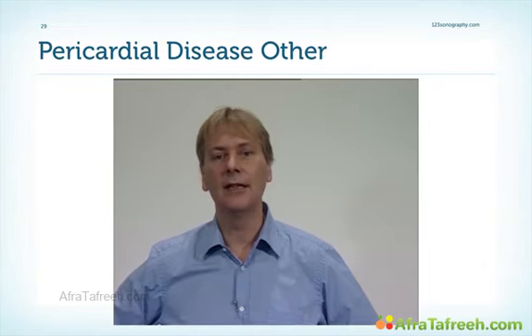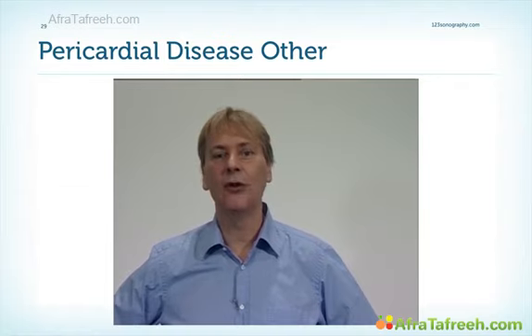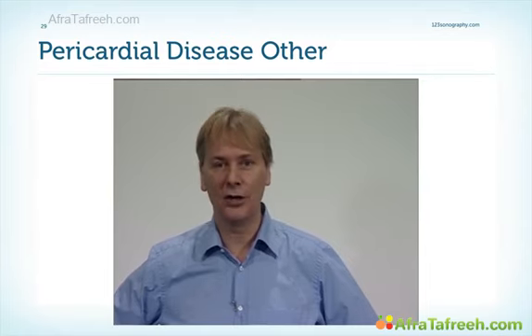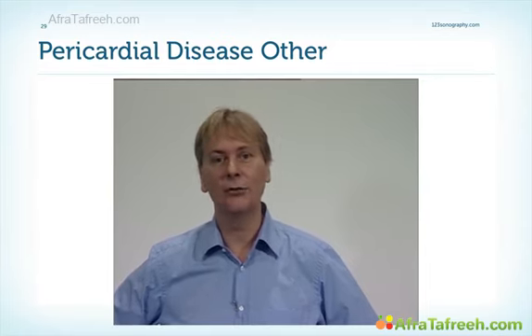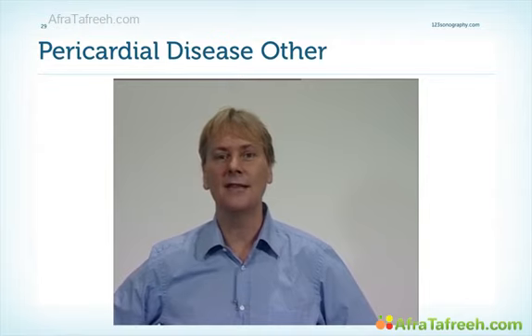I remember at the beginning of my career, when I really didn't have very much experience, I was sent to perform an echo in the emergency department because there was a suspicion of pericardial effusion. And I said, well, I don't really have much experience. And the coworker said, well, all you have to do is put the transducer on the chest. It's easy to see a pericardial effusion. Well, sometimes it is, but as this chapter shows, not always. Some pathologies can be very complex to really diagnose and to interpret. Keep this in mind.